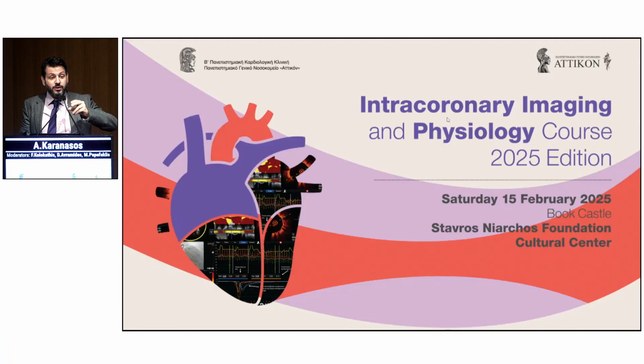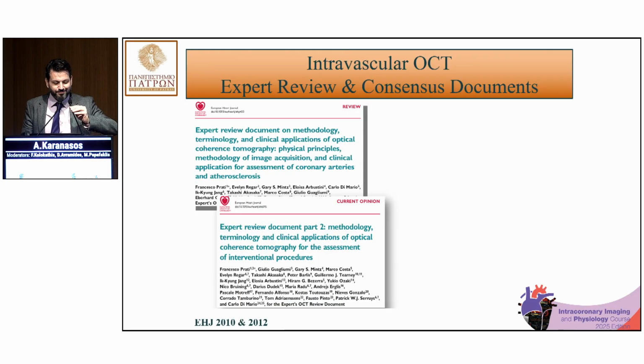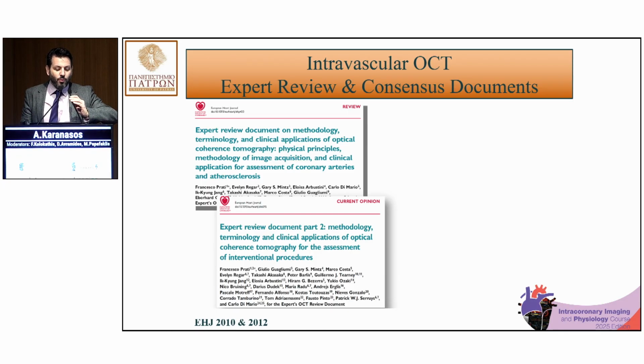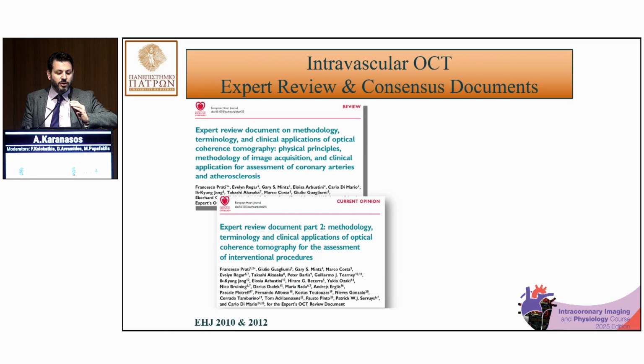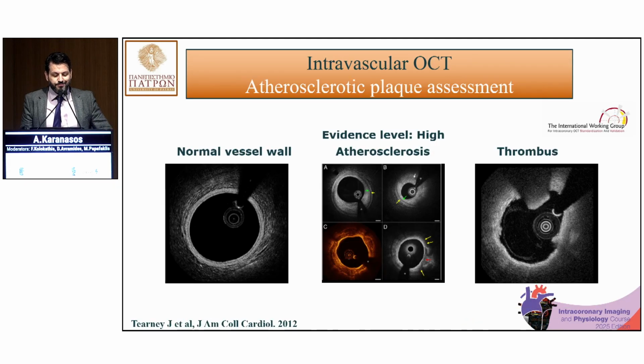I will do this presentation in English to the international faculty, and we will talk about OCT image interpretation. The reason that we now know what to say about OCT and how to interpret it is due to several international meetings that have been called in the past and have made some definitions, some consensus regarding the way that we should interpret the OCT images. This is how we have derived our knowledge regarding the morphology of atherosclerotic plaques by OCT.